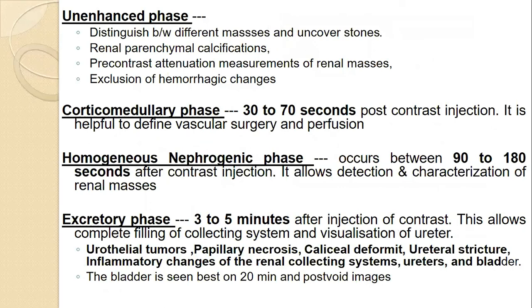So, can anyone tell what the unenhanced CT tells about? Why do we take it first? Rephrase this question. What are the different stages or phases of CT contrast? Yes, Dr. Dumna. What are the different phases? Sir, first there will be a plain image without contrast, then with contrast and the delayed phase later on.